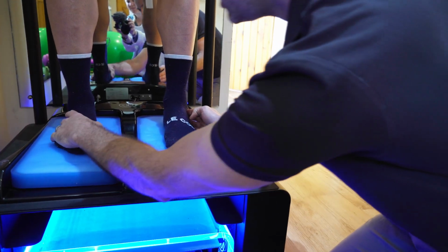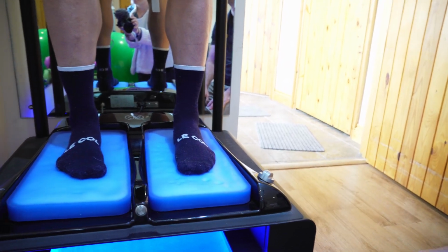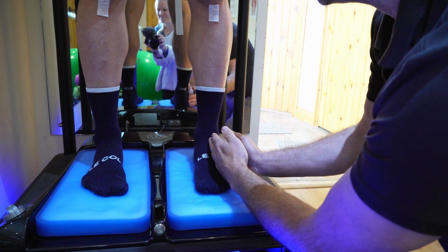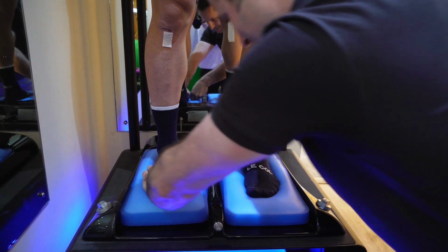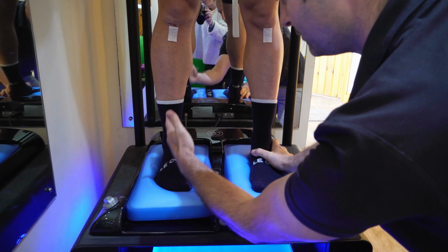That is neutral. And that feels a bit unnatural to you, doesn't it? Yeah. I'm having to hold them out, yeah. Yeah, you're having to hold them out a little bit. But we've got a neutral ankle there, okay? You've rolled in again, mate, so just bring it on out a bit. That feels like the old pair did originally, you know, sort of unnatural, and that's what we're trying to achieve, a nice and neutral ankle.